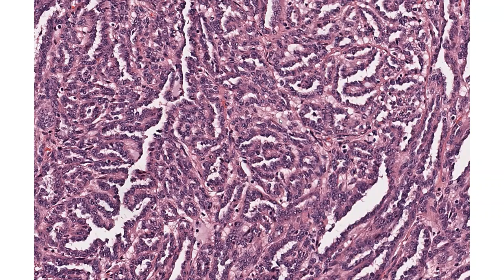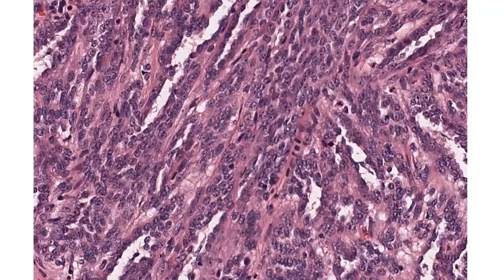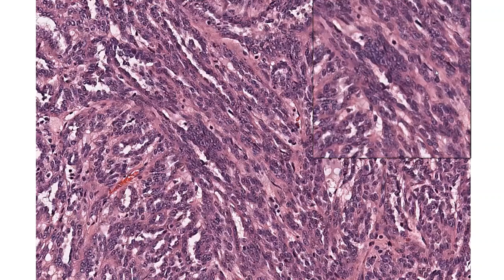However, like here, if you look closely, you'll see that the background shows this pale, slightly bubbly mucin at places, like where my cursor is circling around. So that's an important diagnostic clue. And if you look closely, there will be areas between the tubules where you get these spindle cells, which seem to be growing in a slightly fascicular configuration, like over here. So you have the spindle cell element along with the tubular component. And you will also see the pale, bubbly mucin floating around here and there.